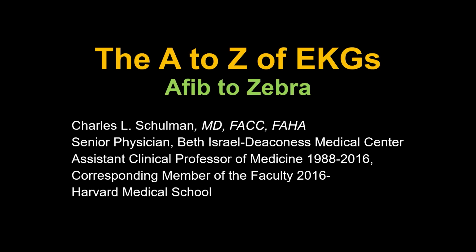This talk is kind of an overview of EKGs. You certainly can't present everything there is to present about EKGs in an hour, much less 3 hours, or much less a whole course. So I have selected certain points to emphasize as we do this.